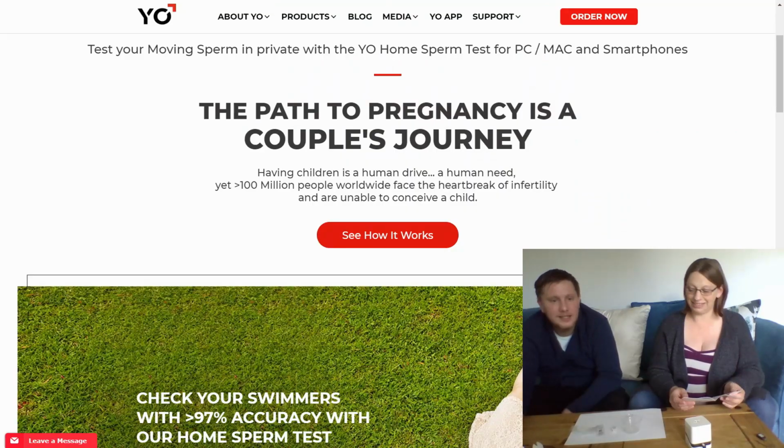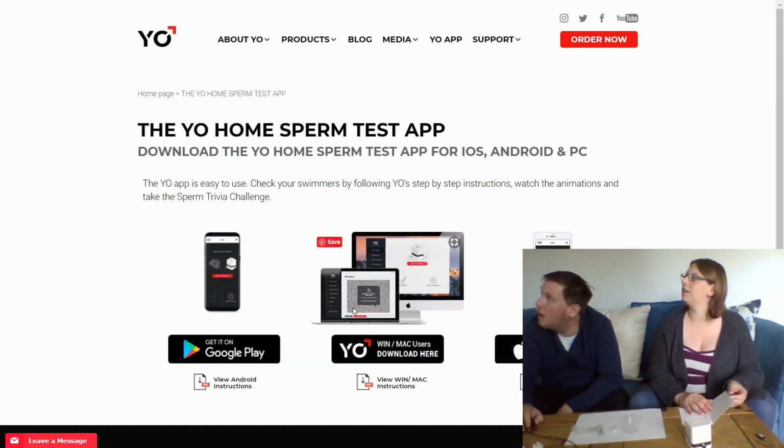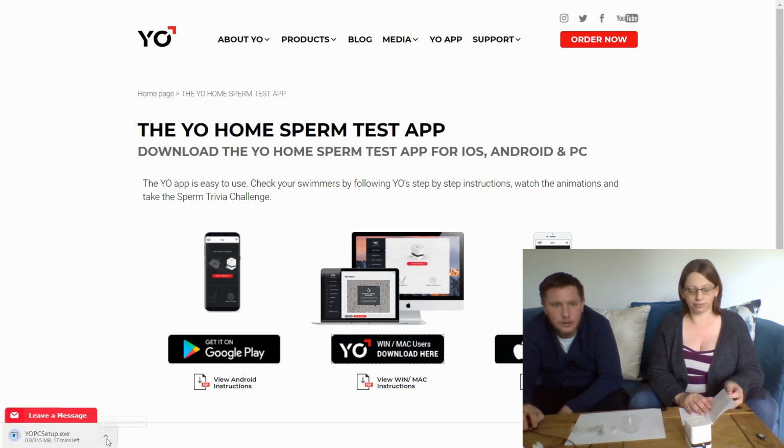So we're back. We went to use my phone, but unfortunately my phone is not working, and it's nothing to do with the app. It's my port where I try and charge it and plug things in has died. So we're actually going to have to use the computer. We've set up a little screen share for you so you can follow the journey. In theory, it's very easy to do. We're just following the instructions on how to download it. So we need the Windows and Mac. That's correct. Download that and install that.